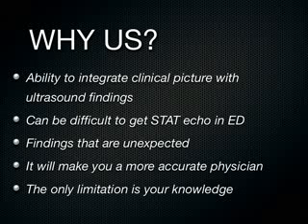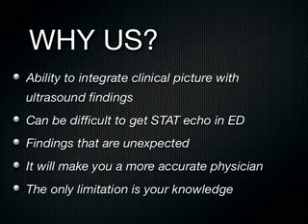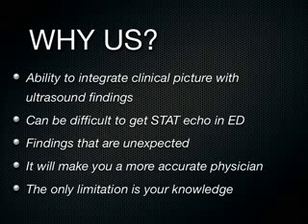So this was an undifferentiated patient. The medical student just happened to be scanning, going bed to bed, and picked that up two days ago. Would that have been discovered with a thorough history and physical? Maybe, maybe not. Maybe it would have been delayed a few hours, but the patient immediately went and had this procedure done two days ago.